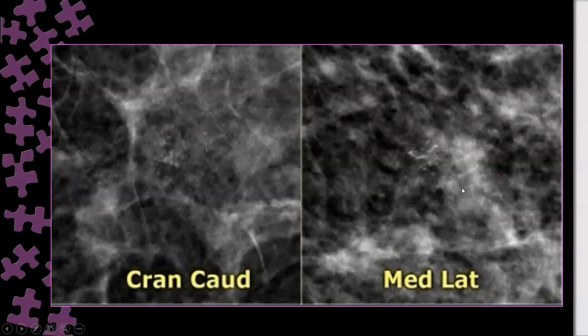But being changed in shape, by itself, this is indicative of something. When changing shape, it goes more linear, or with more magnification you might see something more. This is what we call what? What do we call this appearance of calcium? Yes, excellent. So this is the layering, Fatma.